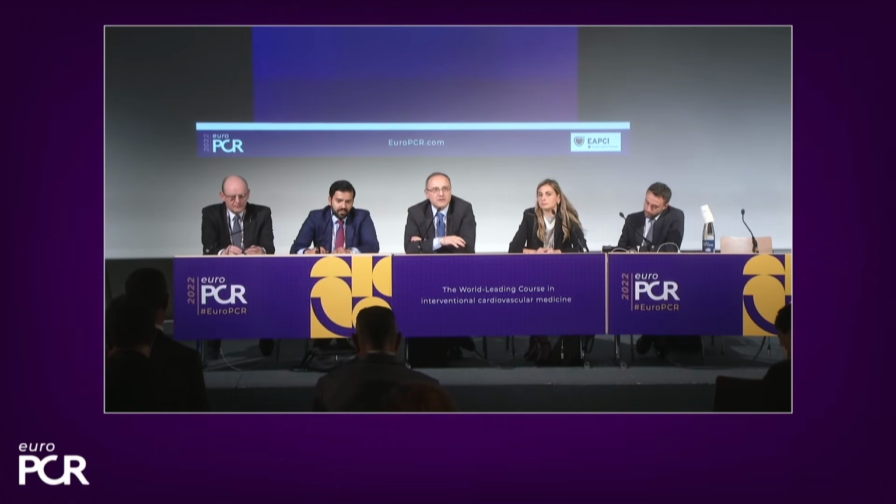We'll tell you at the end of the session. So stay with us. We'll address this question. Drug-eluting balloon. They were used a couple of times in this case. It was used for the distal LAD, and it was used also for this ramus branch.